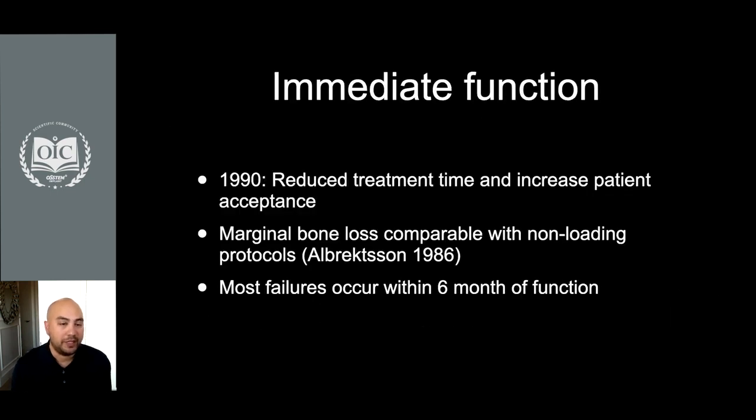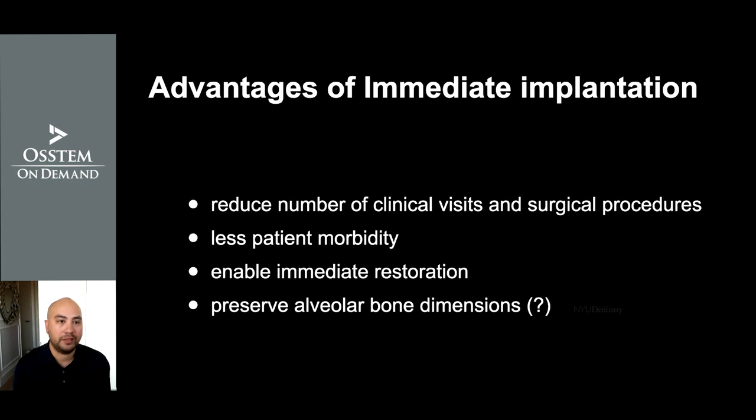One of the most dramatic changes in implant dentistry was the acceptance of immediate loading as an available technique in 1990, with a reduced treatment time and increased patient acceptance. The marginal bone loss was comparable with non-loaded protocols, and most failures have been reported within 6 months of function. The advantages of immediate implantation are that it reduces the number of clinical visits and surgical protocols, and means less patient morbidity, enables the immediate restoration, immediate function, and possibly preserves alveolar bone dimensions.